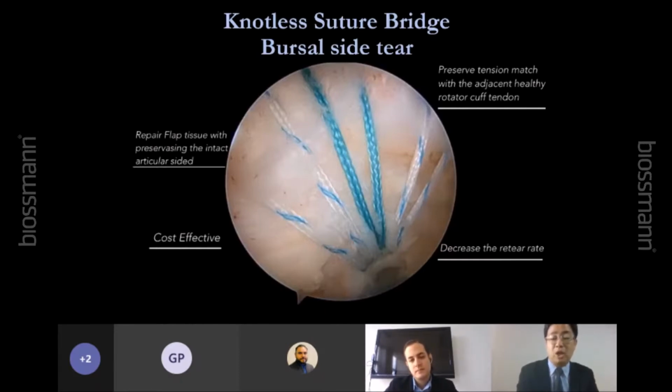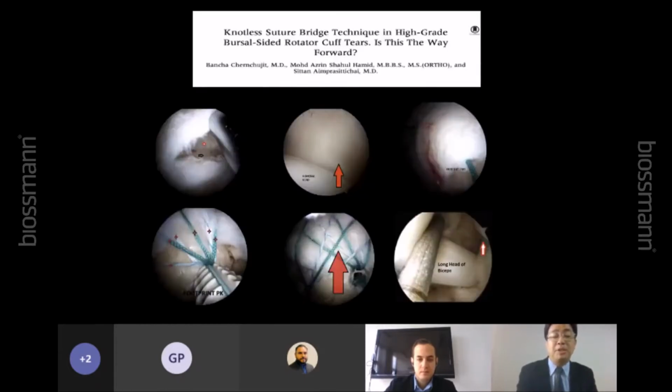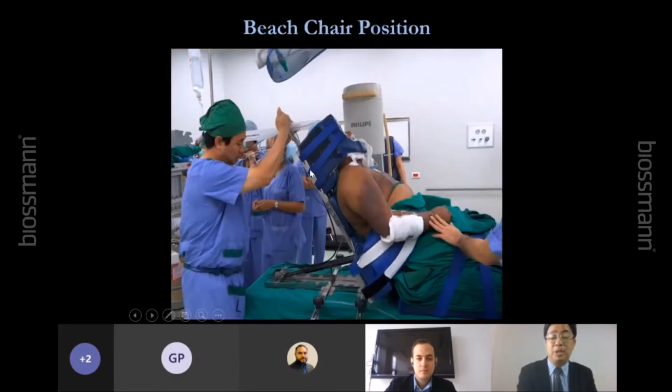Okay, I try to preserve the articular side. This is cost effective. It's safe. You can save money because you don't need to put the medial anchor because the articular side is still intact, and decrease the retear. Okay, using this technique. And we published this article, the knotless suture bridge technique in high-grade bursal side tear. Okay, using only the lateral row, no medial row, preserving the articular surface, right? And we report the result is pretty good.